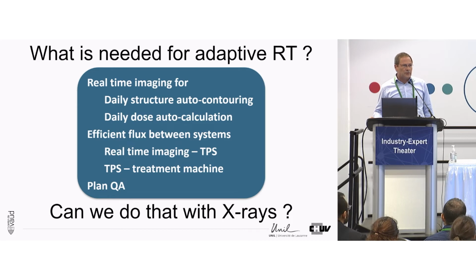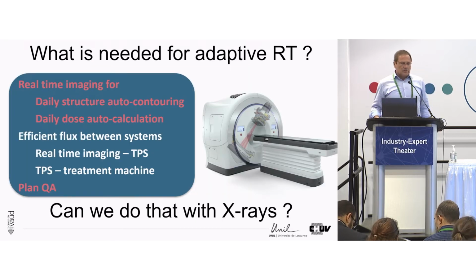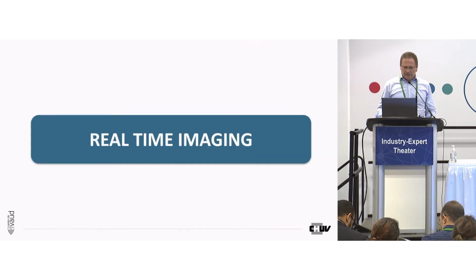The question I try to answer today is, can we do that with X-rays instead of something else? So this is particularly related to RadixAct, as you understood. And so now I'll talk about real-time imaging.